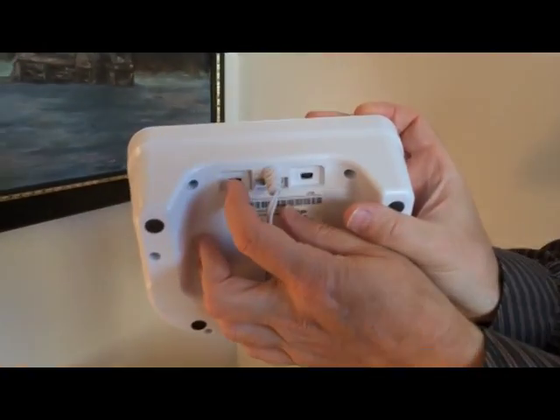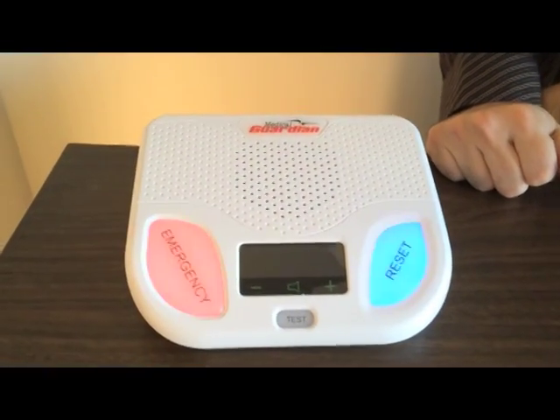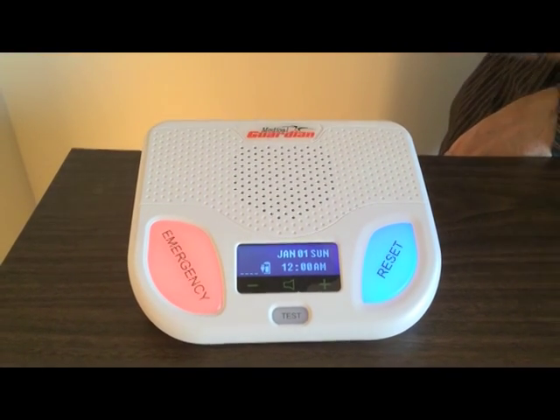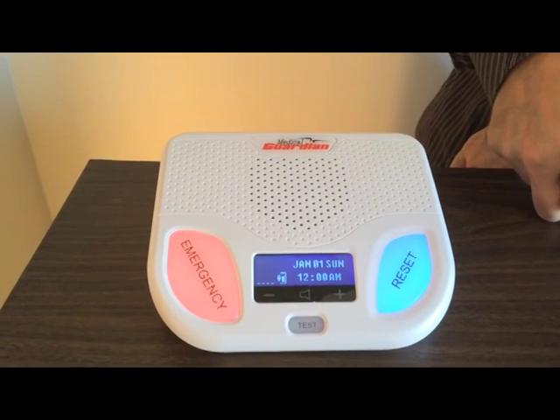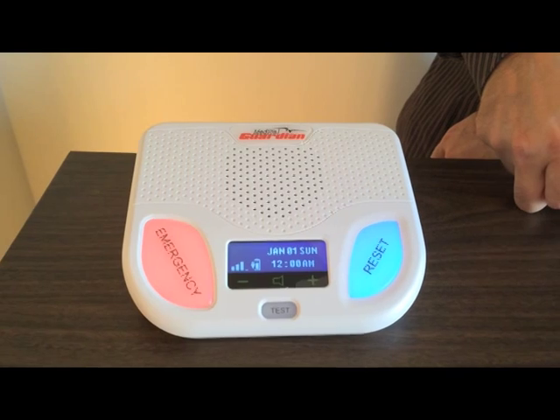So we plug it in and we turn it on right here. The lights come on. It takes a moment for everything to reset and be ready to go. System ready — and our system is ready.